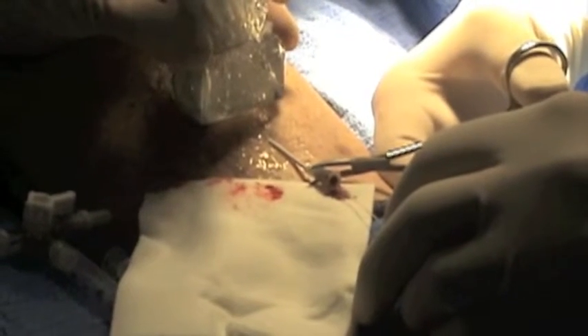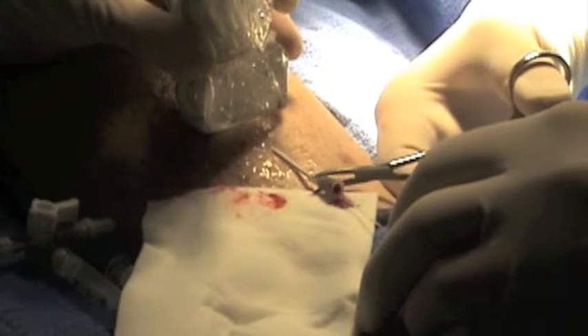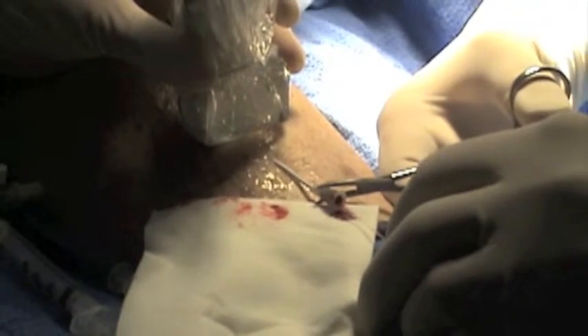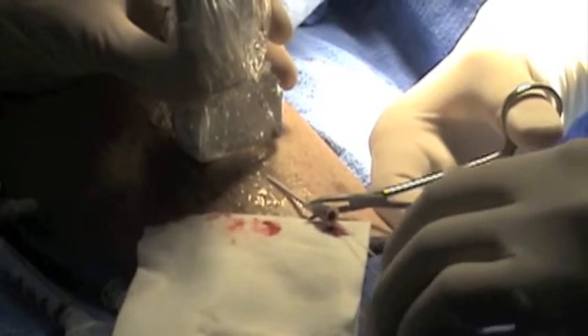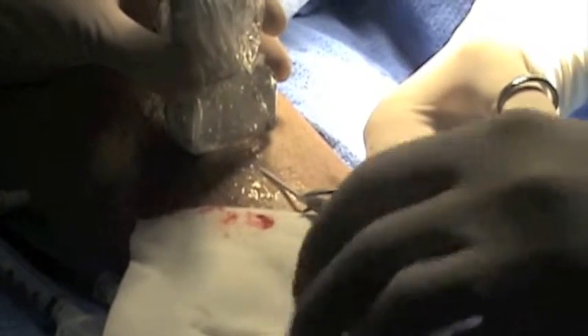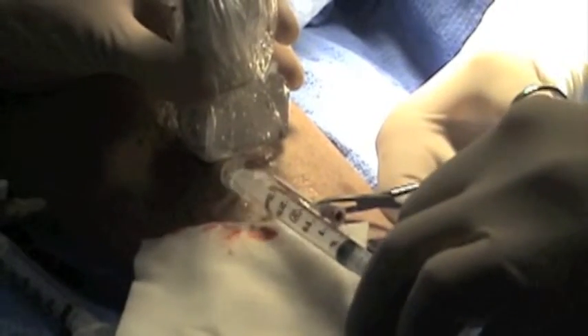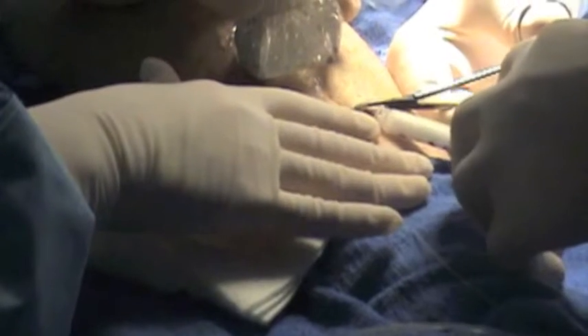The laser filament has been placed. Next I'm going to inject foam into the perforator after I cannulate it with this small syringe. So we're going to mix the foam — I'll show you that in just a second. Now the foam's being injected.